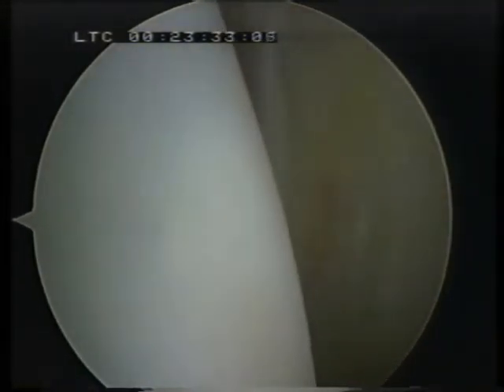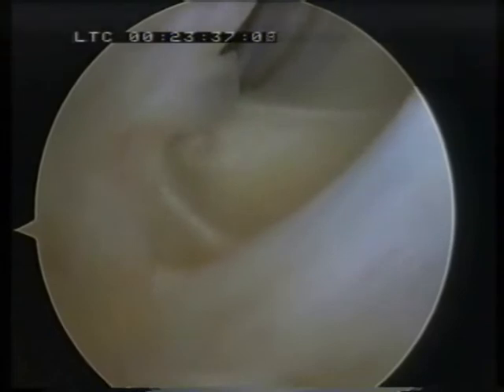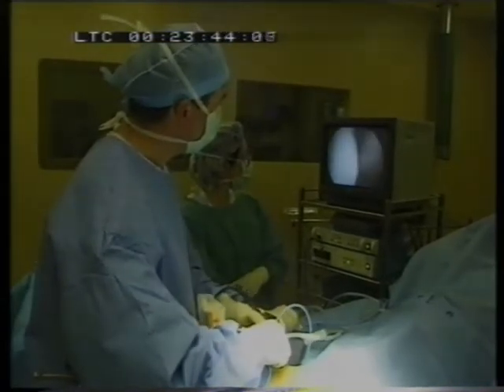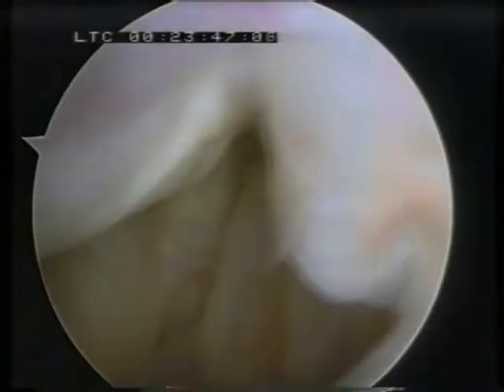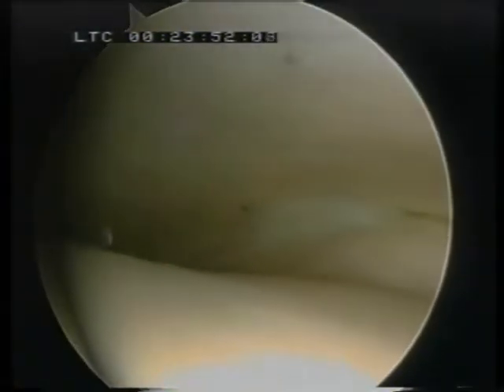Looking down to the anterior aspect of the joint, you get quite a nice view with the 1.9mm telescope throughout the joint. Because we've got a good amount of distraction, we can then look inside the joint and easily inspect the surface.